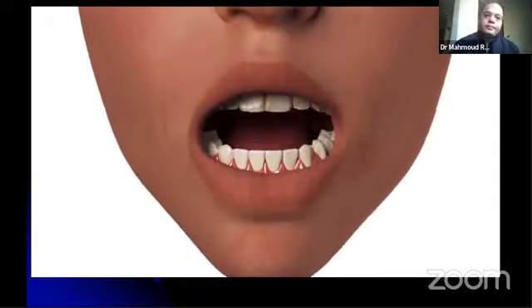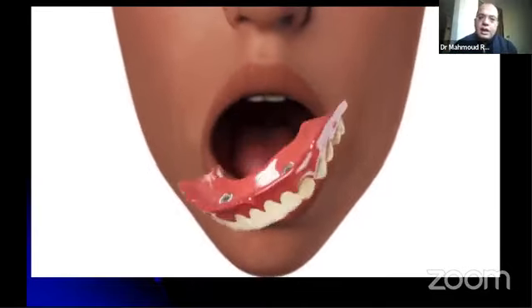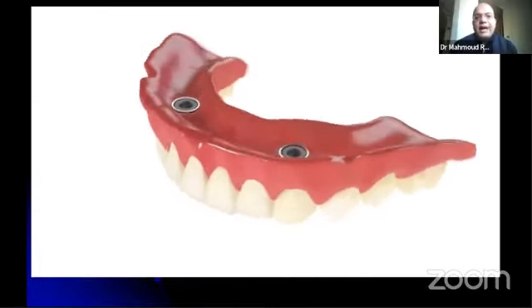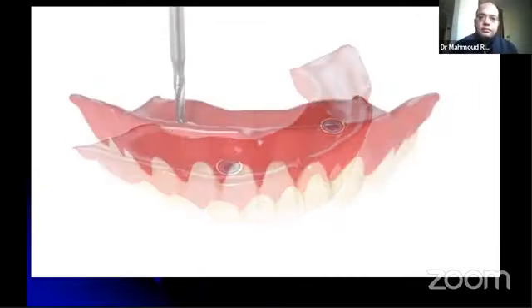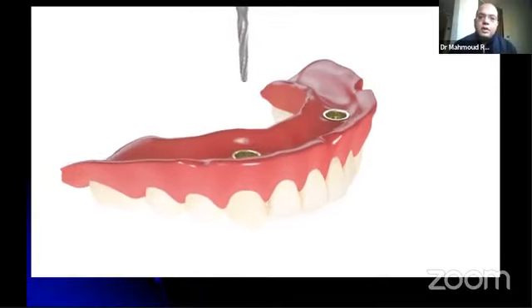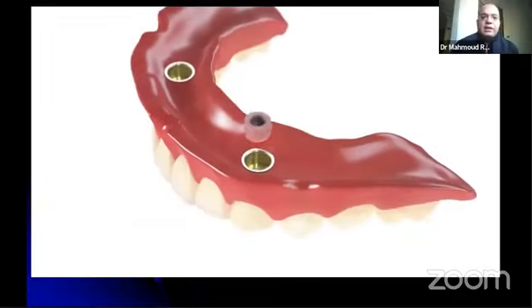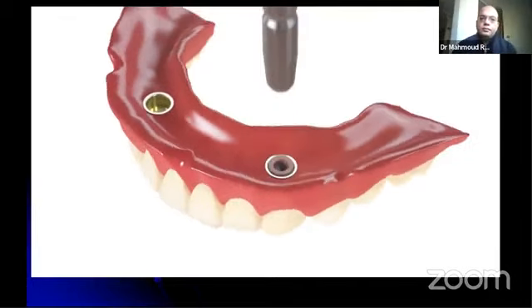After the self-cure acrylic has set, remove your denture and remove the excess self-cure acrylic around the housing cap and inside the vent holes. Fill in the voids and remove excess acrylic. Remove the black lab inserts from the housing cap using a rotary instrument operated at a low speed to avoid damaging the housing cap. Choose the desired retention strength. Insert the retention cap you want for your patient into the housing using the ball abutment insert tool.